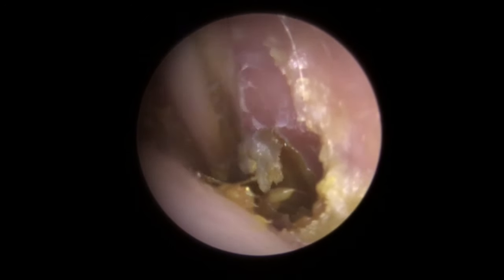Now we're going to go back in and try to get this main body off the drum. Keep an eye on that section there — we're going to zoom in in a second. There we go — watch this as it comes away. We've aimed for that little corner again, we've got a grip on the corner. Look at it — just slide off the eardrum. Perfect. So that's come away — we've uncovered the majority of the eardrum there.